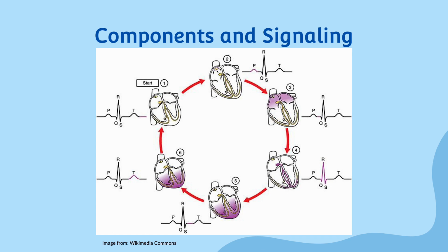On this last slide, there is a photo that associates the P wave, PR interval, QRS complex, ST segment, and T wave with the nodal and signaling structures. Please take a moment to understand which EKG tracing component is associated with each structure, as it is crucial to the EKG foundation and being able to interpret EKGs on your exams and in the clinics.